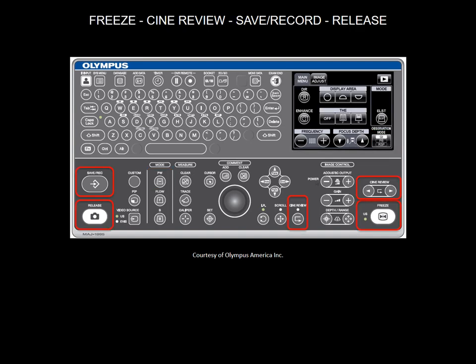The machine allows you to freeze and unfreeze the images on the monitor to examine fine details. Still images can be stored and transferred by USB ports.